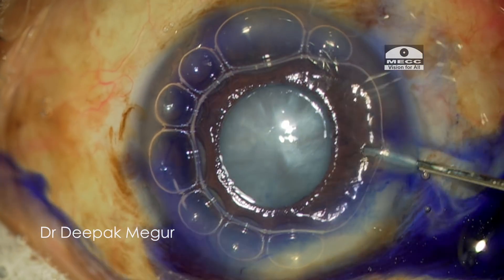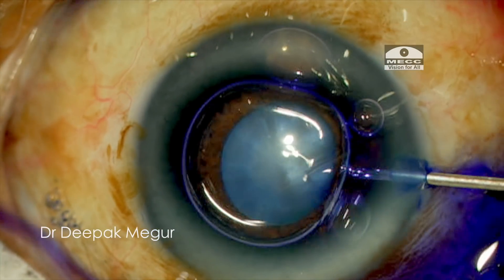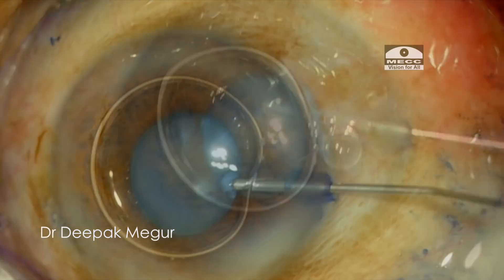For the pupil, my plan is to just perform a stretch pupilloplasty and see how things go. If that does not work, then I plan to use the B-Hex ring for pupillary expansion.